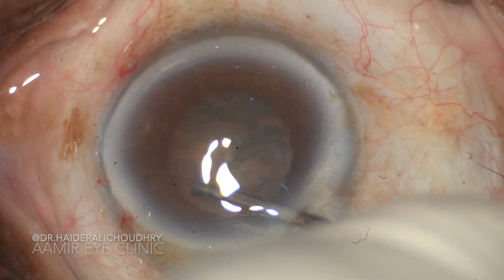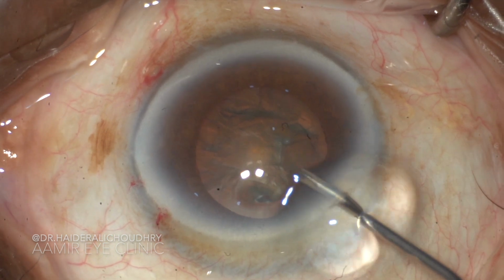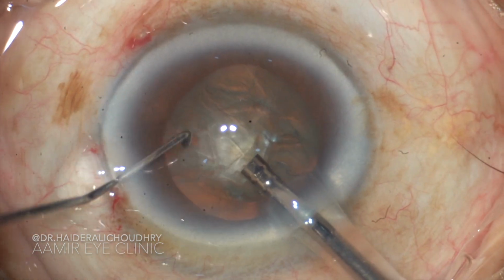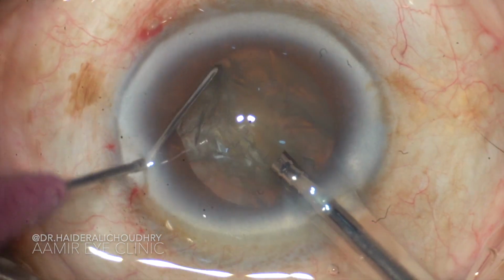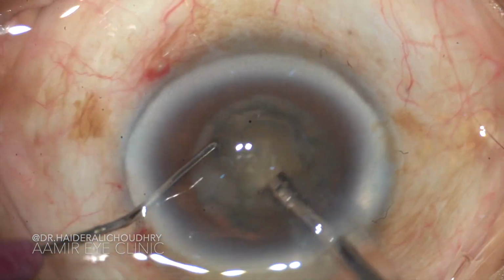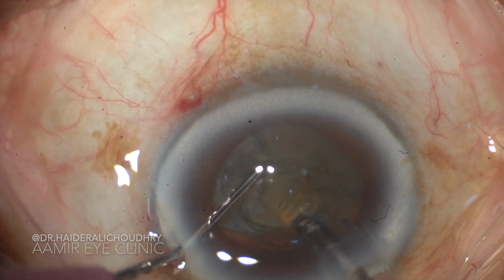We perform a hydrodissection. A fluid wave goes behind the nucleus towards the opposite equator, and we rotate the nucleus to release all the cortical adhesions. Now we are performing the phacoemulsification.